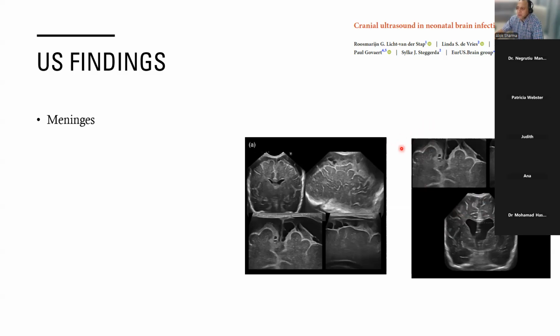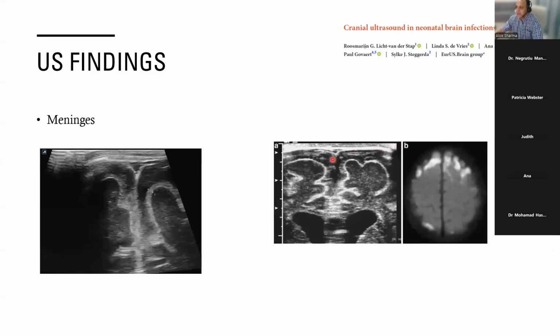But these are acute and chronic changes that you can see in the meninges. This is just, again, a slightly closer image with the linear probe. And can you see how thick the pia layer actually looks? The arachnoid layer, there's exudate, again, a very bright kind of appearance to it that you see. Now, from my perspective at this particular point, again, it just worries you a little bit, but you have to clinically correlate. Here, there's absolutely no doubt.